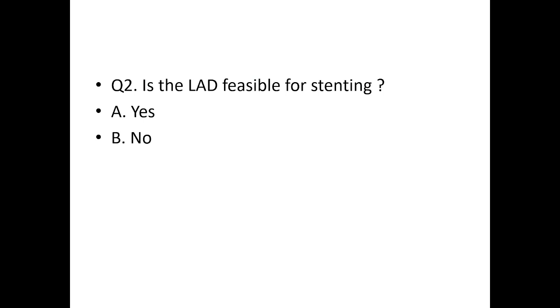Then is it feasible for junior colleagues? Is it feasible? Yes, it's very much possible. Let me just recap some theory. The LAD has a stump with a pencil tip, and with the retrograde flow we can assume that the totally occluded segment is small. The lesion segment is small. So we tried for the LAD.